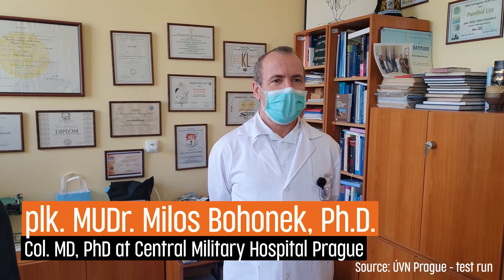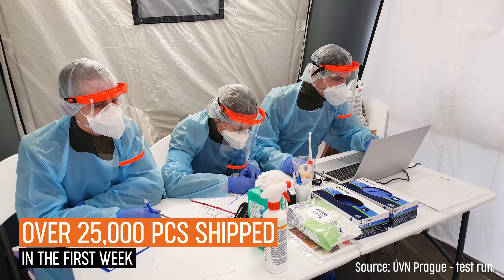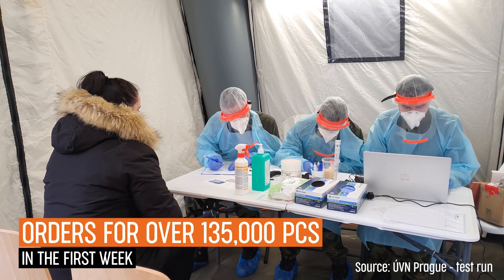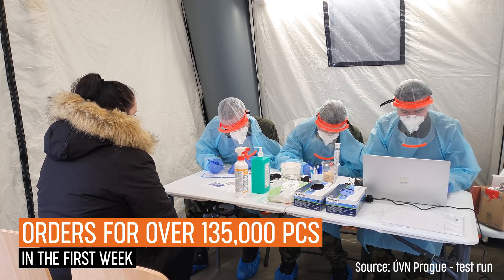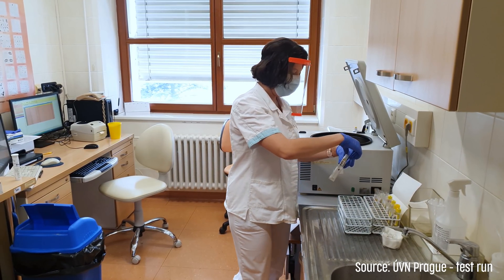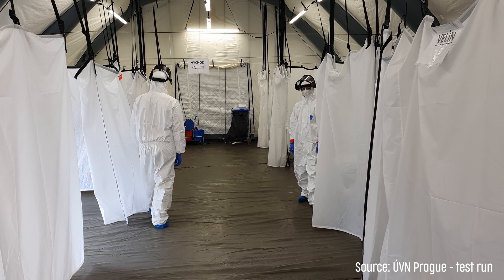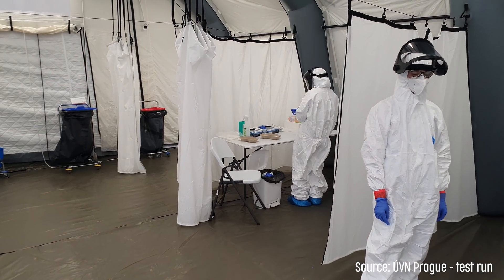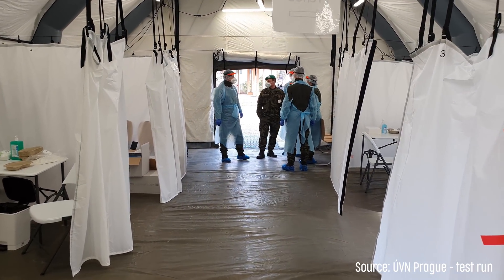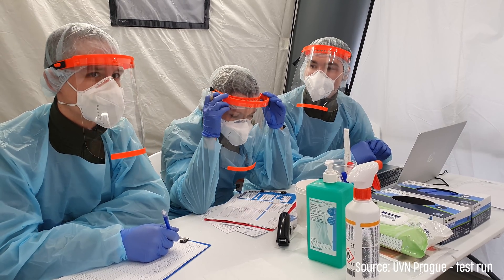Protective face shields for healthcare professionals are certainly good protective equipment, especially for doctors in the first line who come into contact with people potentially infected by COVID-19. They are also very suitable for laboratory workplaces where infectious material is being manipulated, because the disease can be transmitted not only through the respiratory system but also through the mucous membranes and eyes. A plastic face shield can help protect medical staff from all of these. The feedback from our staff is very positive — they really like that the shields are light.